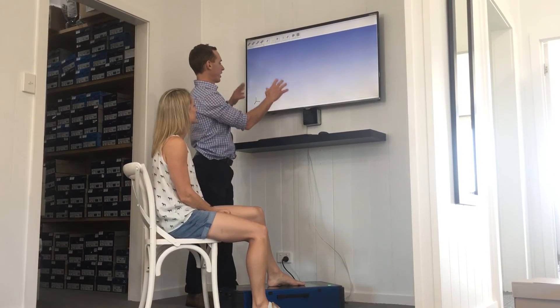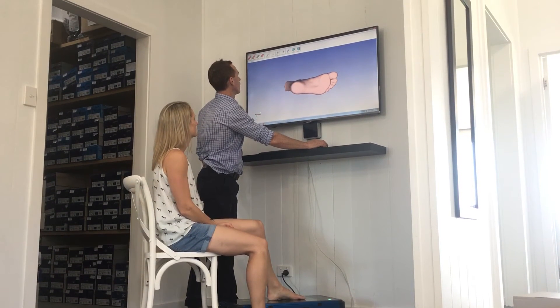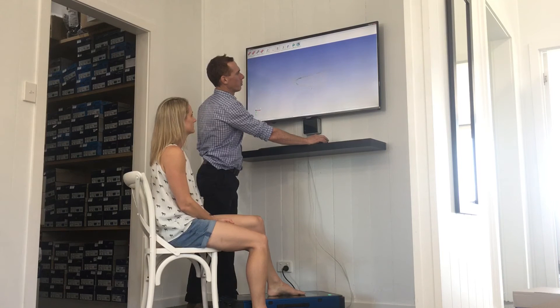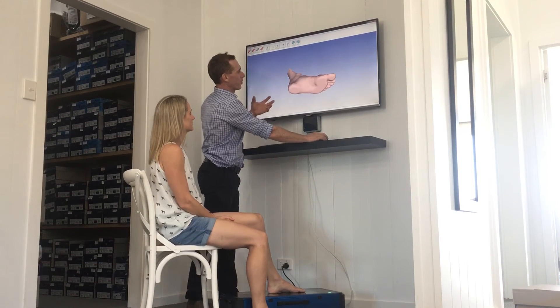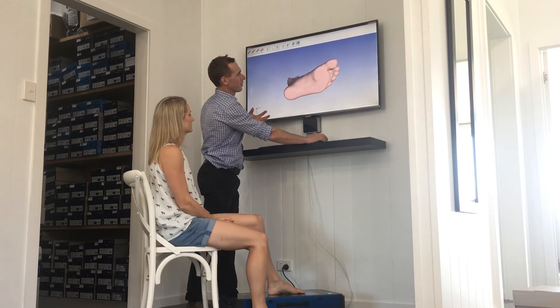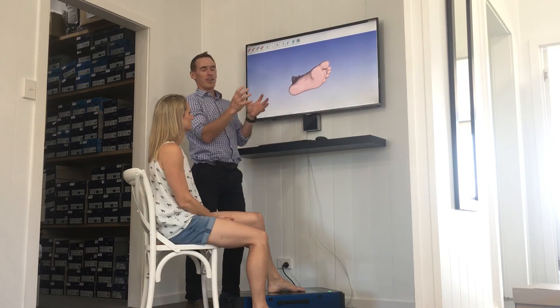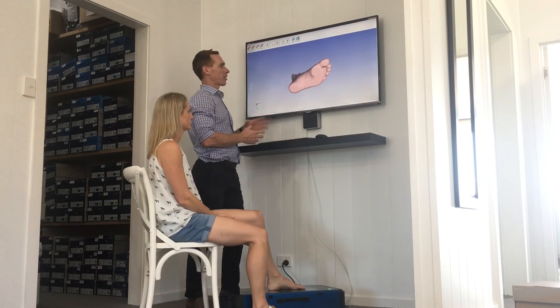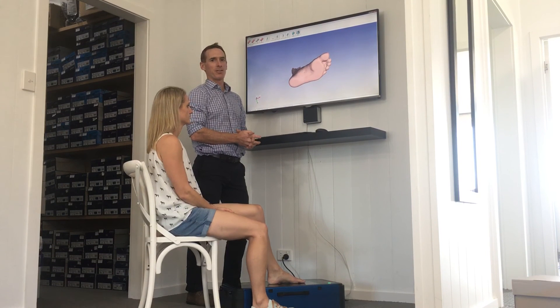That point cloud then comes up onto the computer and we have all these thousands of small little points plotted against the foot, and that all gets meshed together to create the foot in 3D. So once we've got that picture of the foot, we can take that and do our orthotic design — the same as a traditional plaster cast or a foam box, just a more accurate digital version.